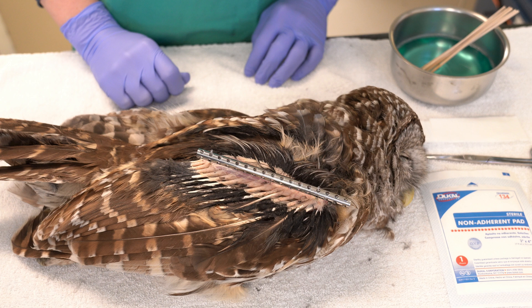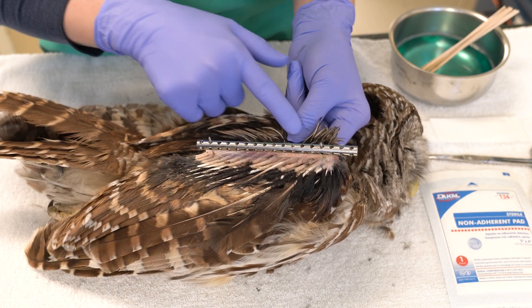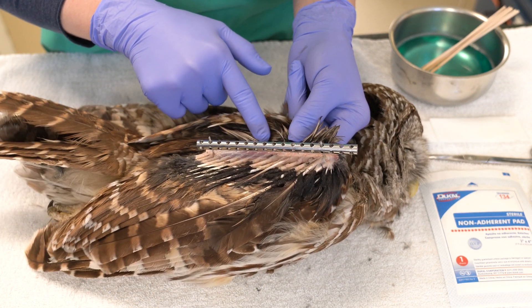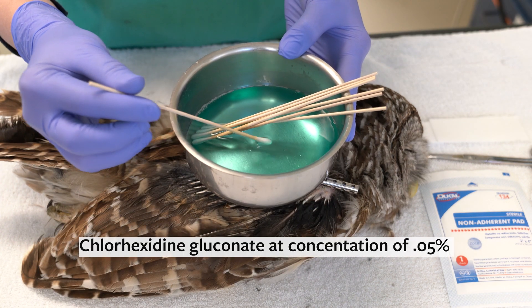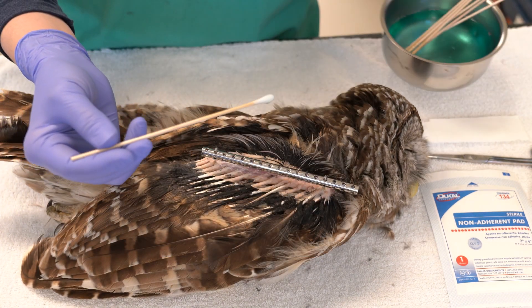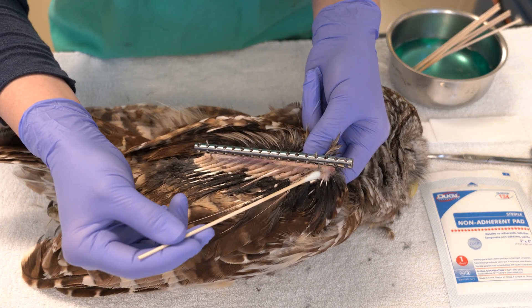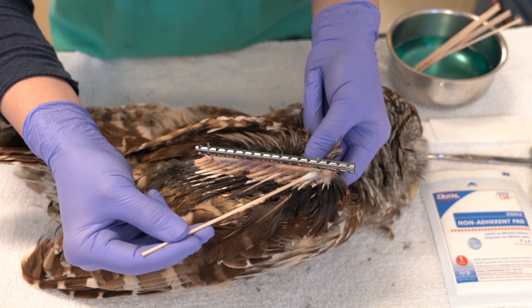We will begin with wound management using this deceased barred owl, which I have placed a surgical fixator on the ulna post-mortem as an example of a post-operative site. All pin sites should be checked and areas of discharge around pin sites and surgical incisions should be cleaned with dilute chlorhexidine gluconate, then rinsed off with sterile water after one minute of contact time daily while active discharge is occurring.